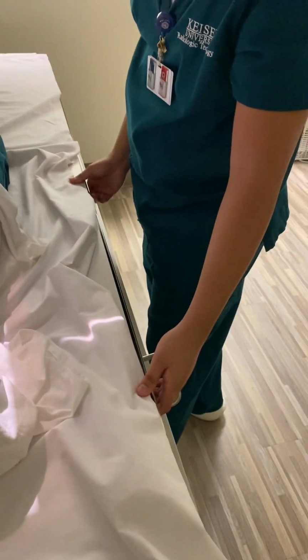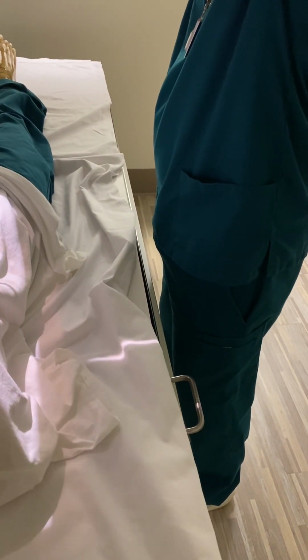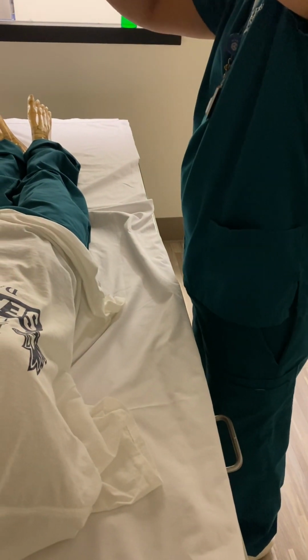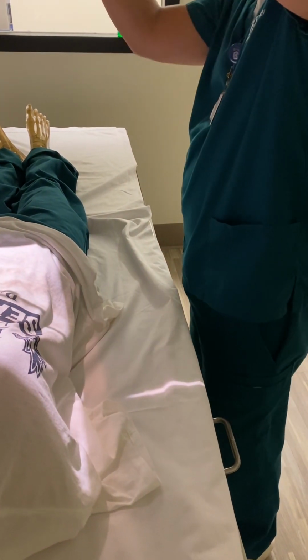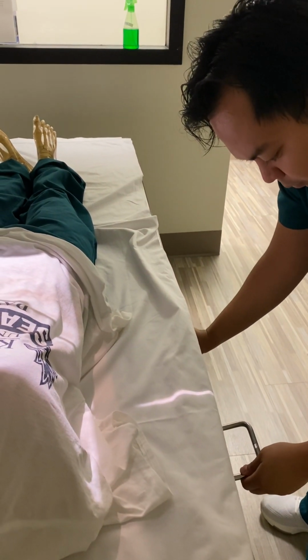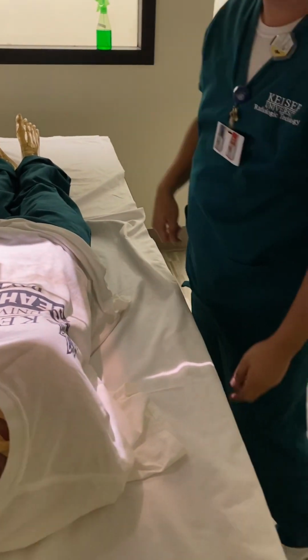So always adjust your tube according to your relation to your digital IR here. Make sure you have enough room. So I have enough room.